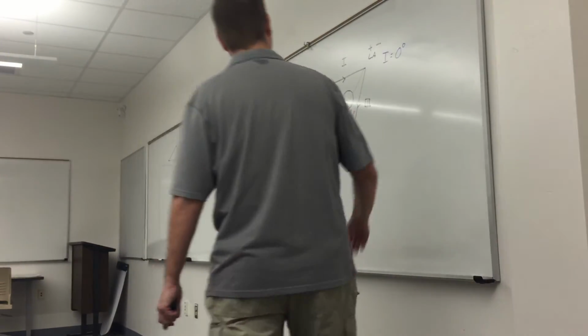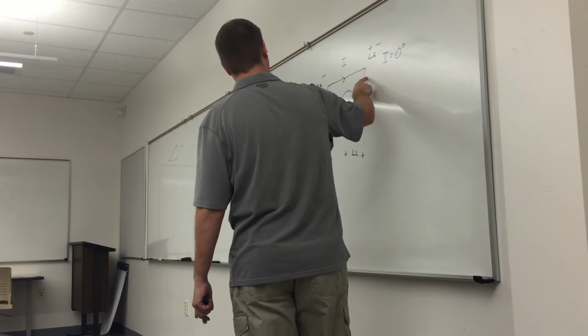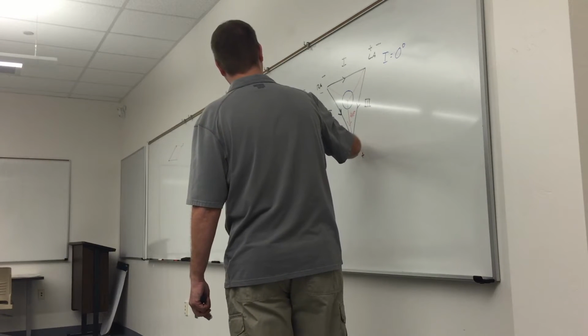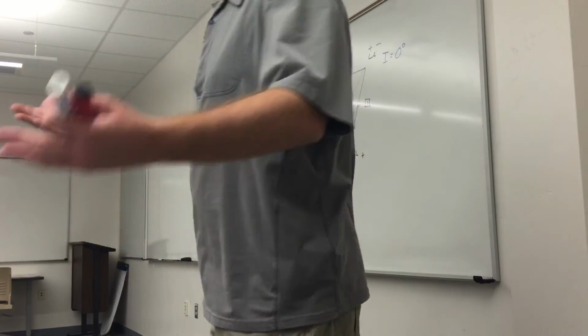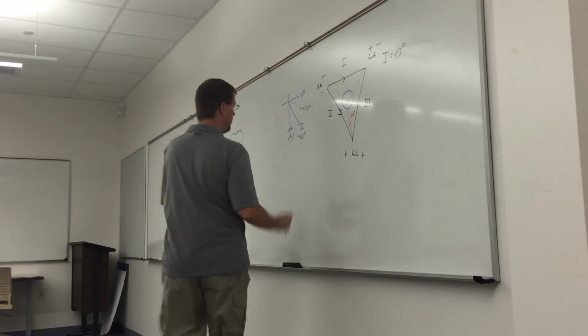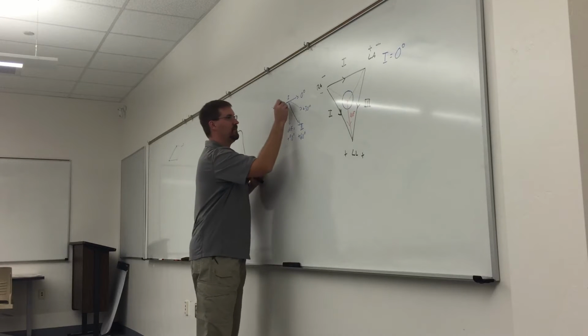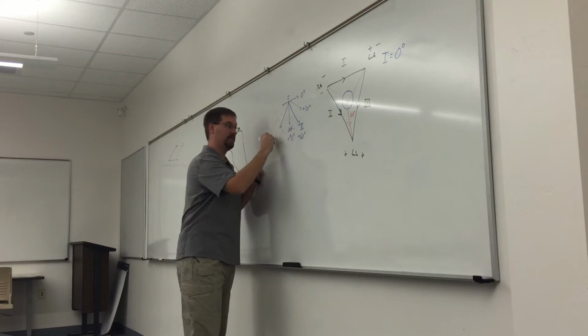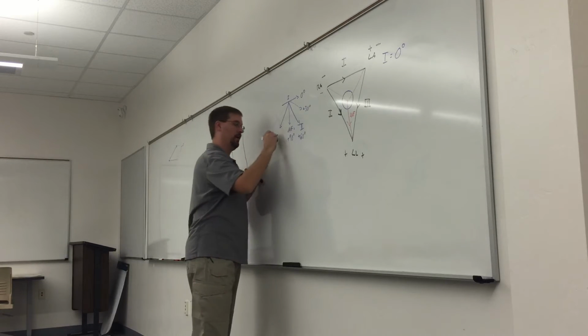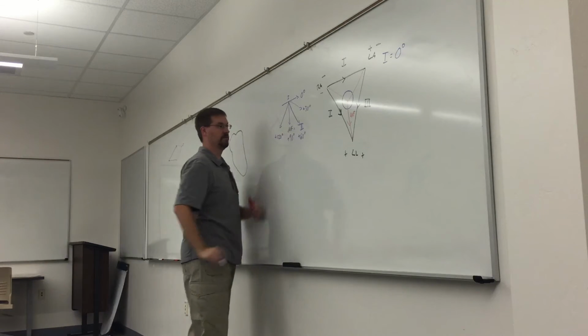So what direction does 3 go? It'll be 120. You guys are right there, aren't you? Lead 3 is a reflection of lead 2 coming out that way, and it would be positive 120 degrees.